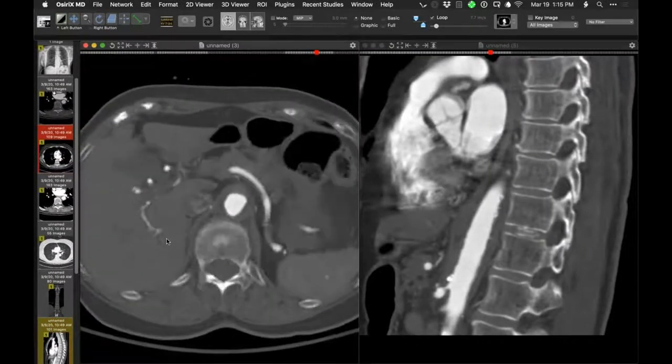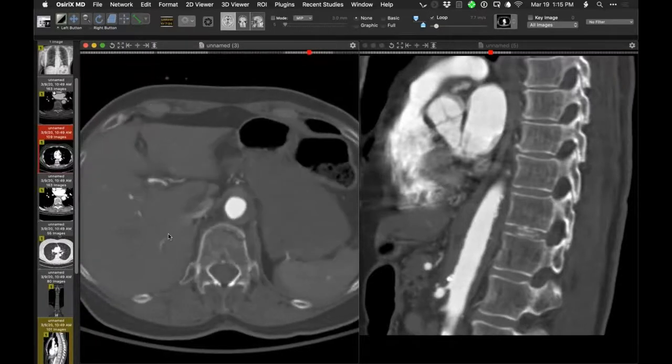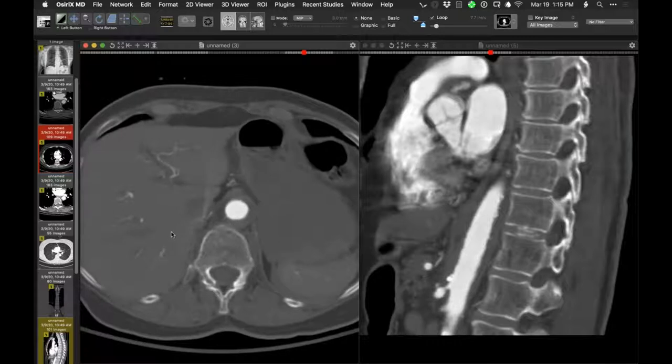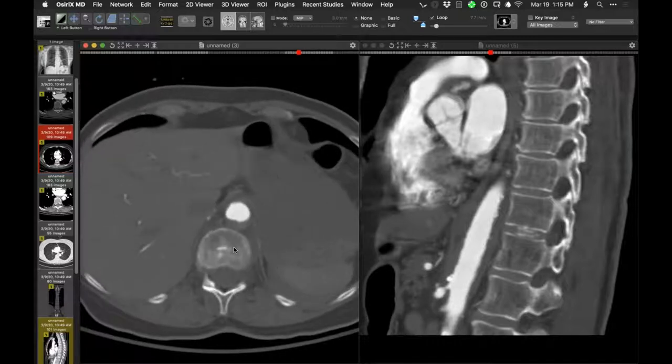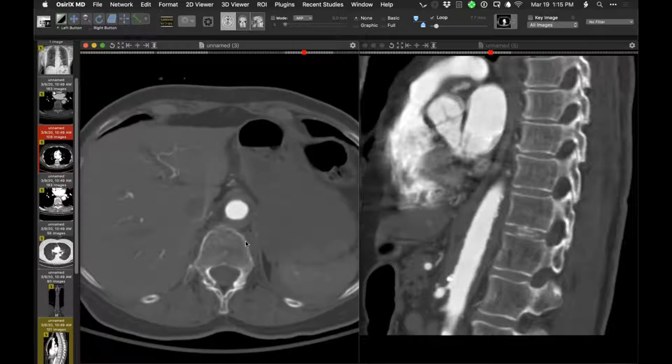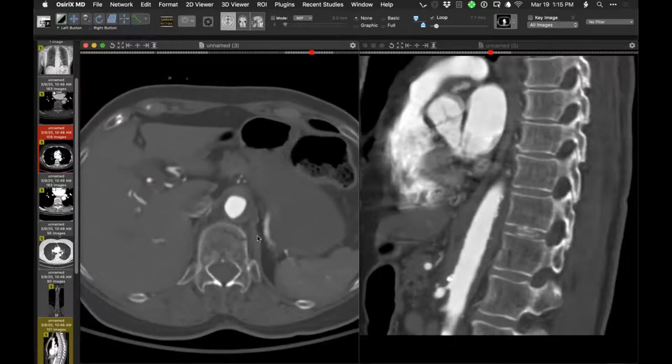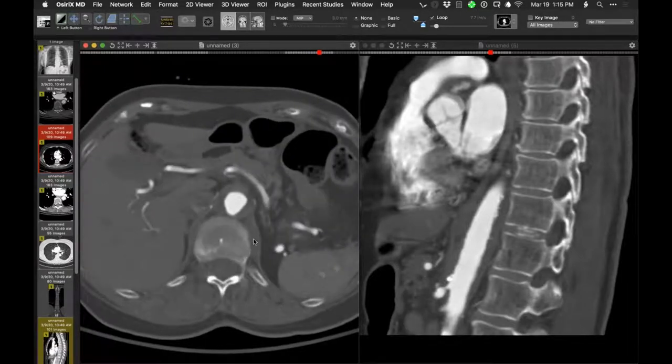I wonder, are the other people muted, or are they just stunned? No, I think it looks like an intramural hematoma. It's interesting, there's a little bit of air there that came from somewhere. Yeah, as part of the injury. I think the subtle paravertebral hematoma is a nice clue too, even if you overlook the aorta or the fracture, because that's a subtle fracture. Exactly, just near the crura.